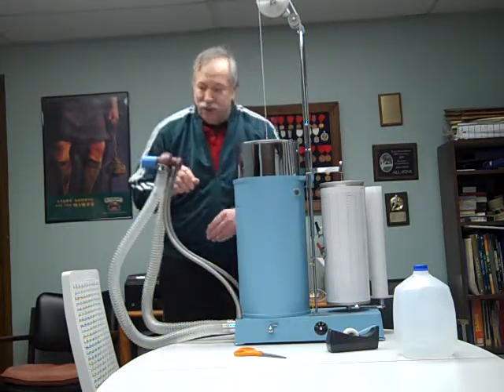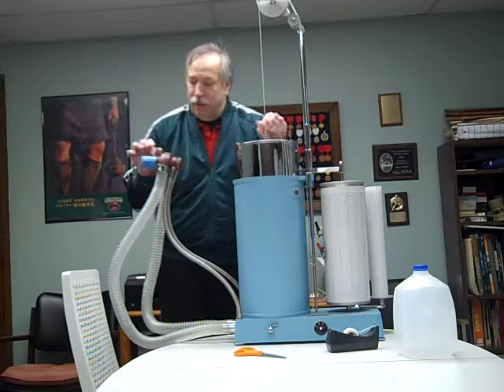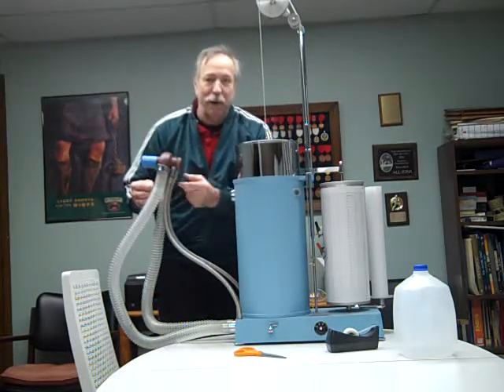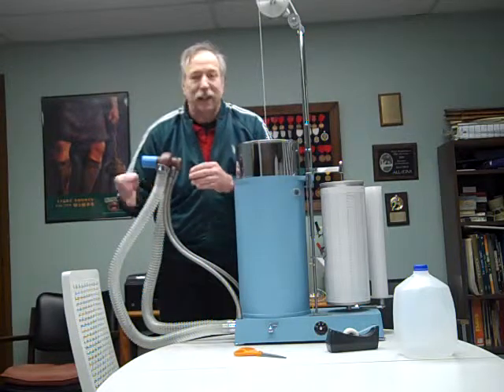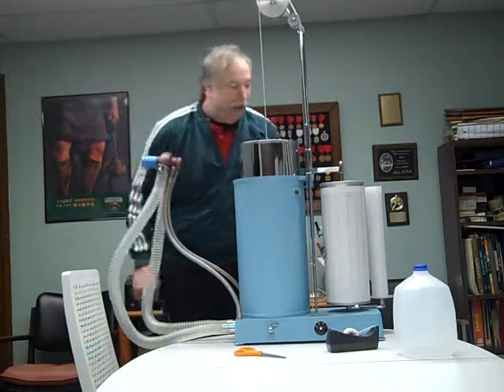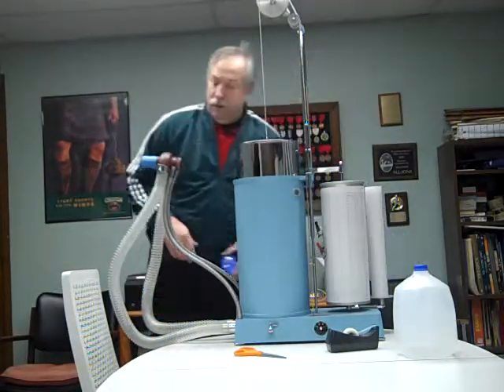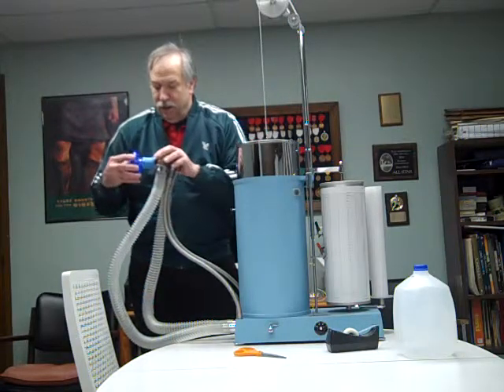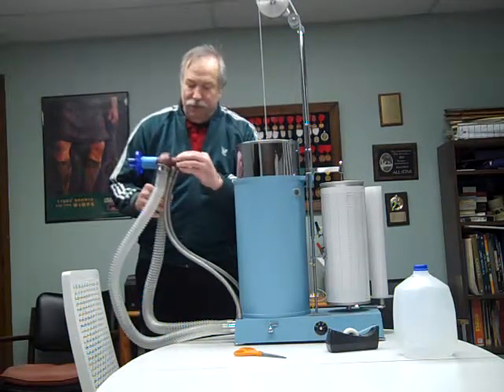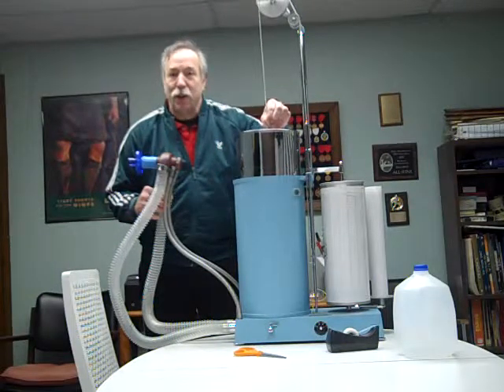And we have our tube and our closed system. We have a little valve that we can shut — now no air goes in here. The patient can actually breathe through an opening in the bottom of the valve until they get comfortable with the mechanism. Once we get the valve and the patient ready, we would get our nose clip and filter and put it on our machine, turn the valve, and the patient's breathing in and out — and we'll be able to start our exam.